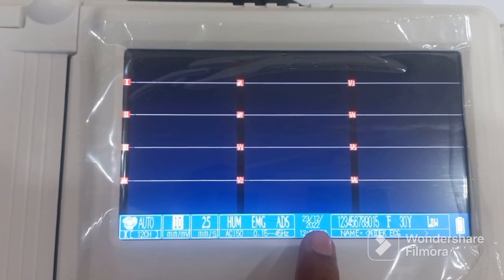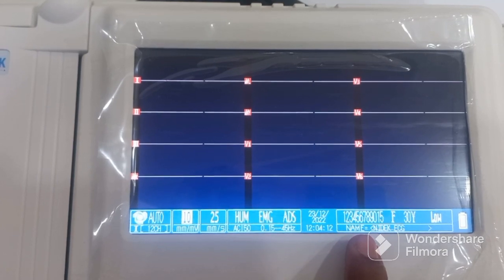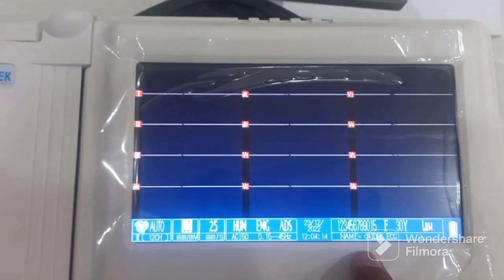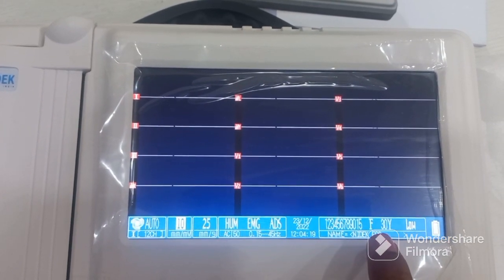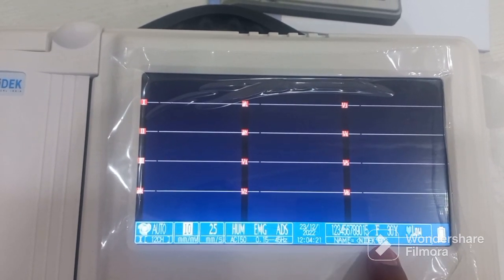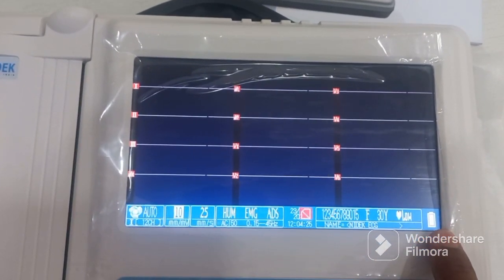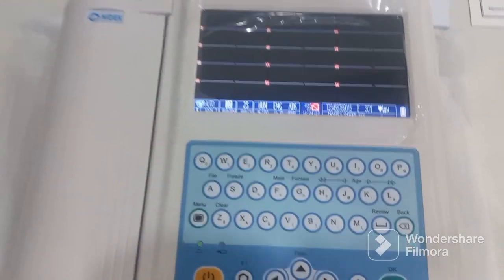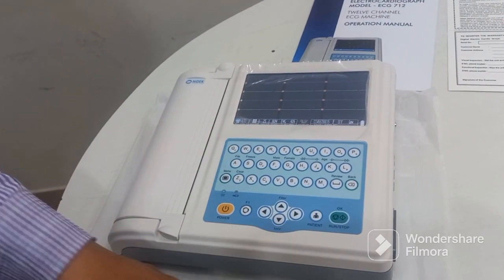Here you can see the sensitivity, the printing speed, and three filters which should always be on. There is the date and time, and all patient details like the patient name, the patient ID, gender, age of the patient, and a battery indicator.